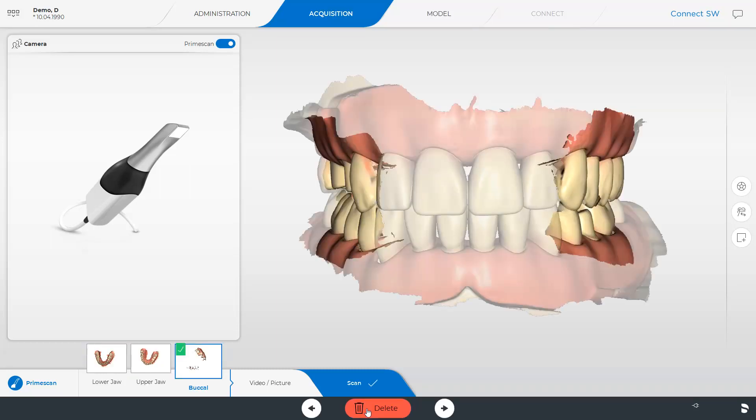As we have defined restorations in the upper as well as in the lower jaw, we have performed two full jaw scans. And in the case of the buccal image catalog, a bilateral scan was performed. A bilateral scan influences the allocation of the two jaws positively. There is no specific scan protocol necessary when scanning with PrimeScan.